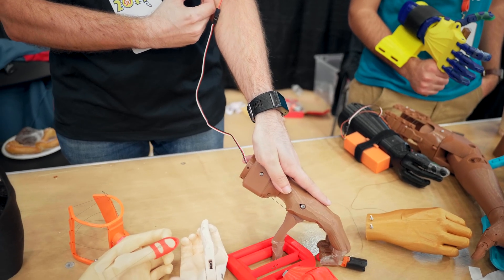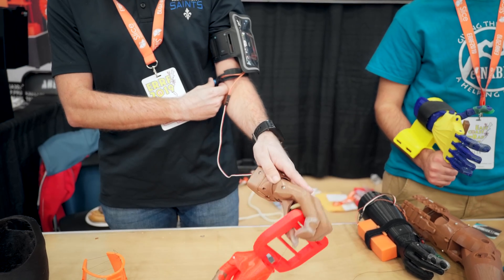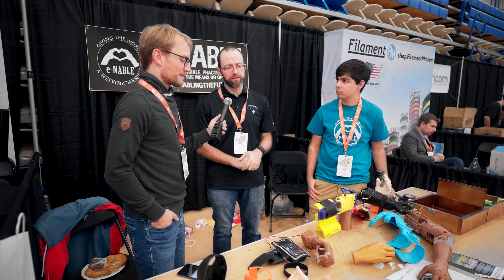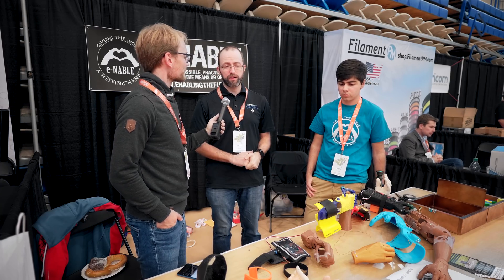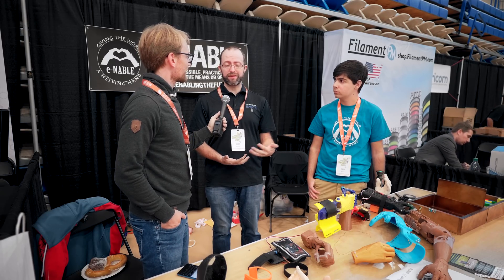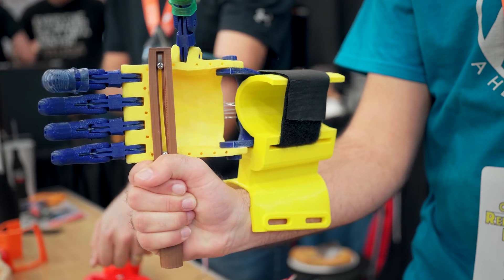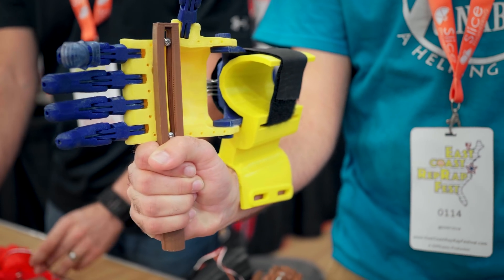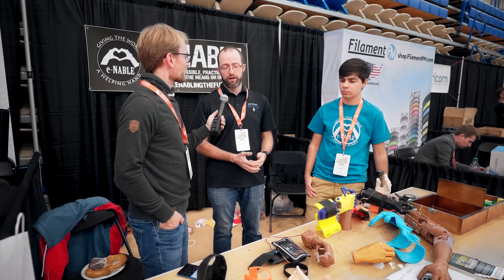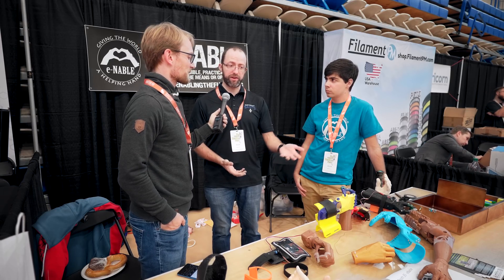So two last questions. How does the process work to get enrolled and start printing hands for people? We have a website — everybody can go and sign in, tell people I have a 3D printer, download one of our designs, print it up, submit some pictures, and you'll get a digital badge saying I can make this design and we'll approve you. Then you're set to start getting matched with people. We have another website that will match you with the recipients. A recipient comes in, they upload some pictures and their location, and we try to match them with somebody that's local to them. And they print the hand and give it out.